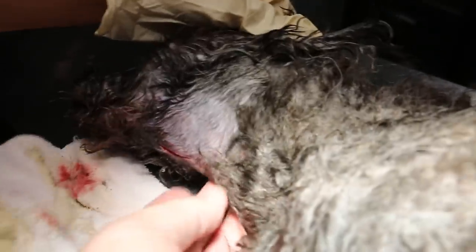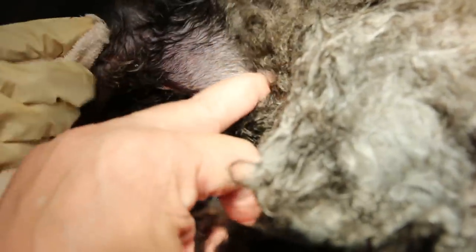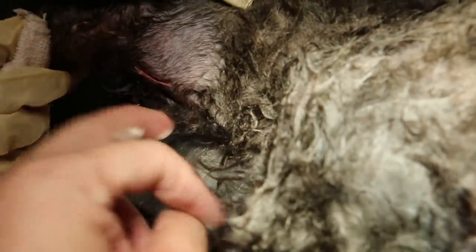Now we turn over to the other side. And you can compare to the x-ray. You look at the x-ray, the swelling here was really obvious. In fact, the owner complained that there's a big swelling here below. And from the x-ray, you can see that the abscess, the pus has gone upwards here. Have a look at the x-ray afterwards.